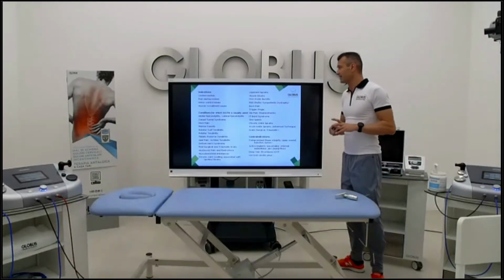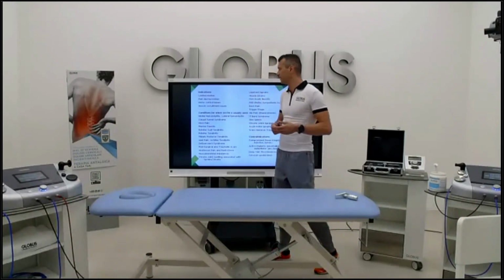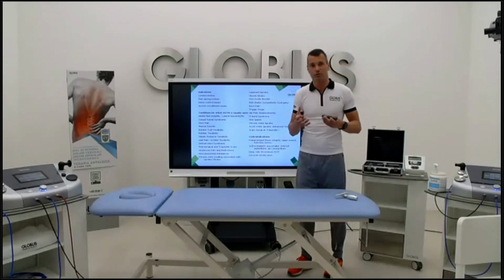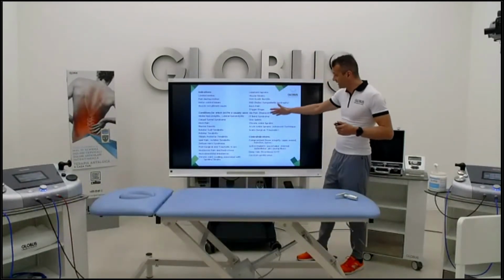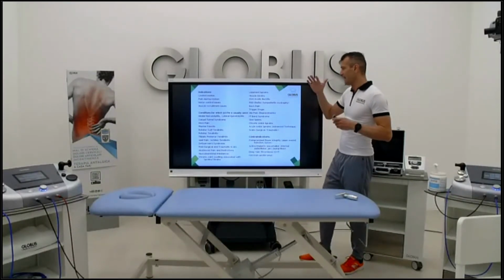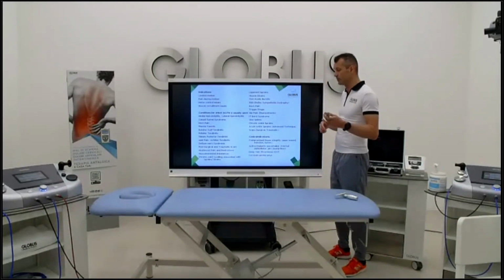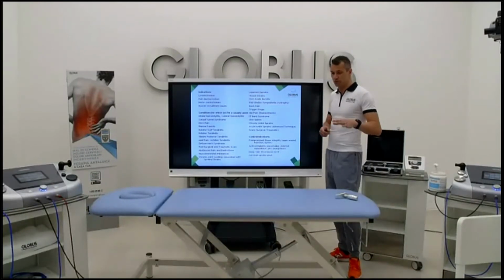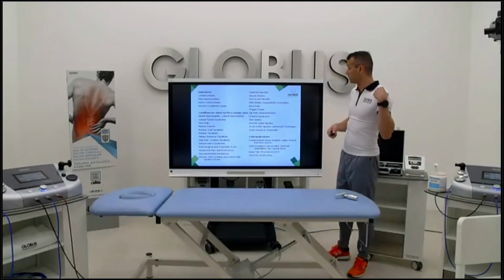The indications are really a lot, like limited range of motion, pain during movement, as we said before, the motor control pattern. As you can see here, there are a lot of conditions where we can use this kind of technique, like epicondylitis, carpal tunnel syndrome, neck pain, plantar fasciitis. Today we're going to speak about some of them, as I told you, mostly around the lower limb anatomical region.